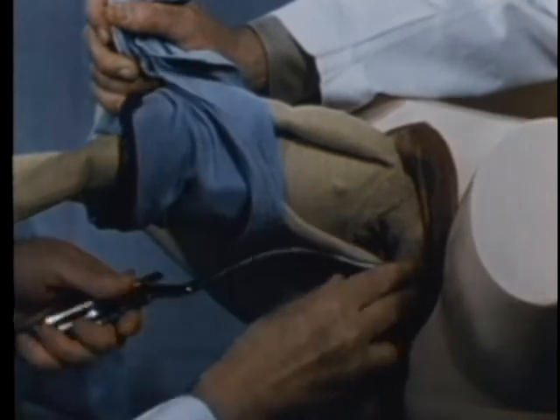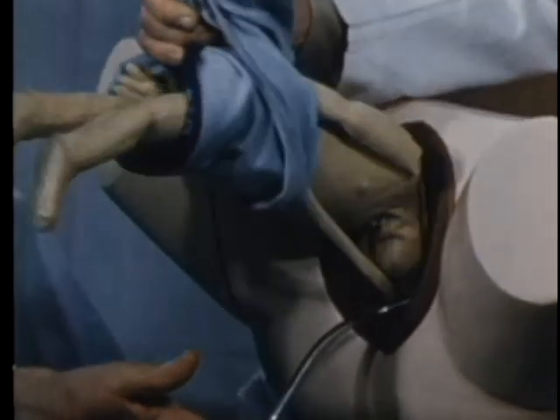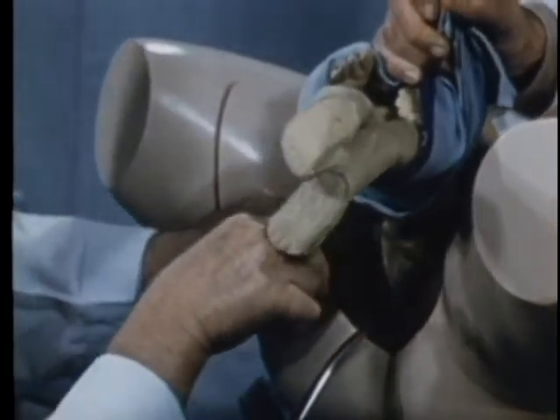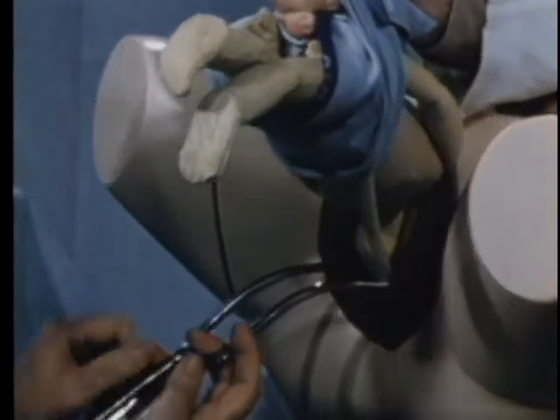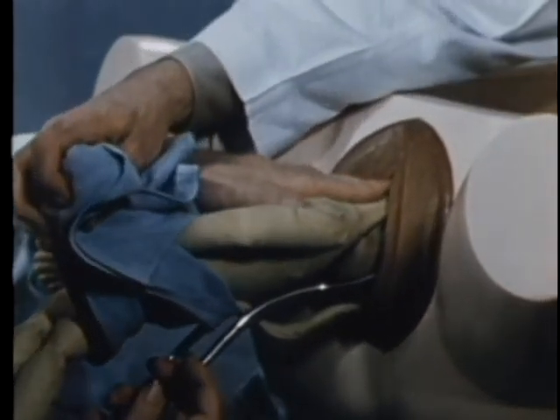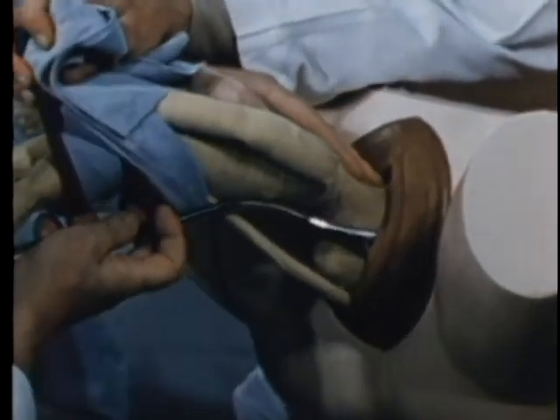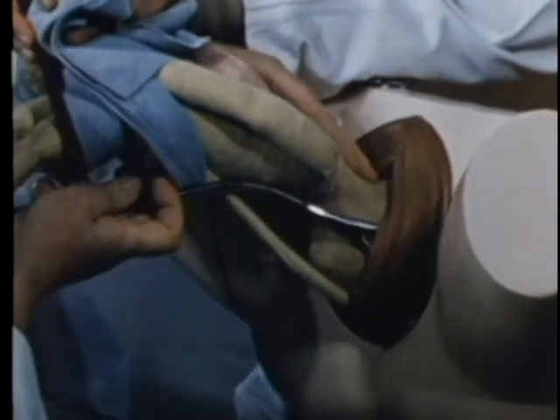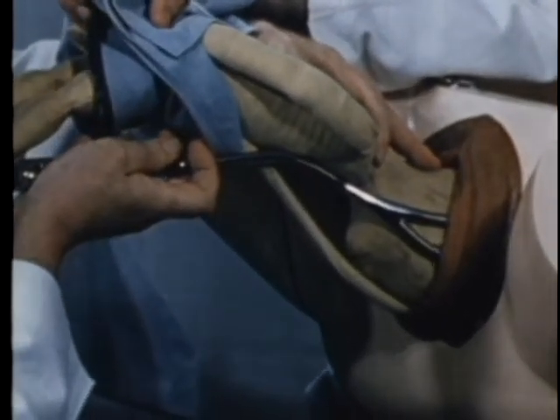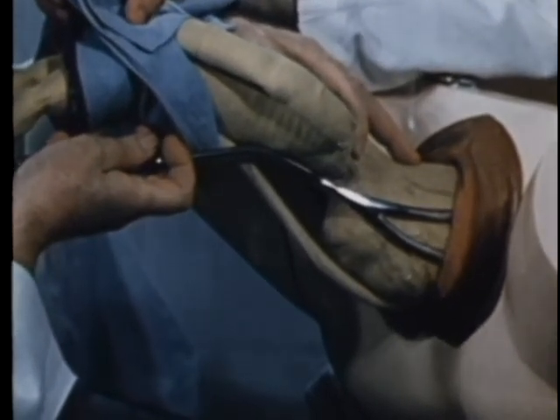Left blade to left side to right ear. And the body is carried to the opposite side. Right blade, right hand, right side, left ear. Then the body is lowered to the level of the shanks. The left hand of the operator splints the neck. Pump handle maneuver. Gradually making progress until, with good flexion at the outlet, the head comes out with the handles at the level of the horizontal.